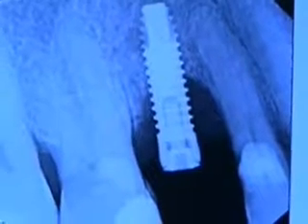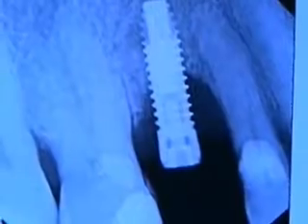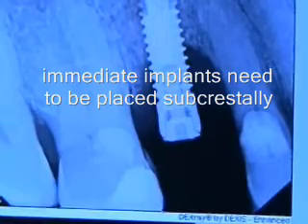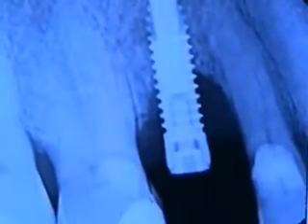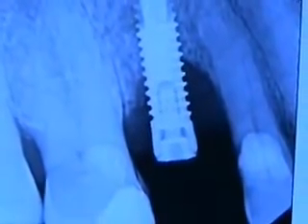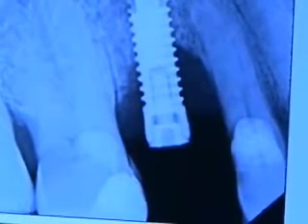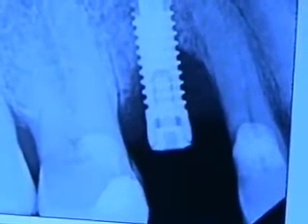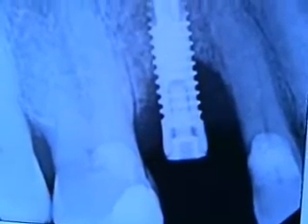This was an immediate implant with an immediate provisional. Looking at this, the implant, the crest — the coronal edge of the implant is right at the CEJ of the other teeth. There's plenty of room to place the implant further up, and that would have been nice. I spoke with the dentist that did this implant and he said there was infection and no palatal bone. It's probably not a good indication to do an immediate implant at all unless you could really bury it.